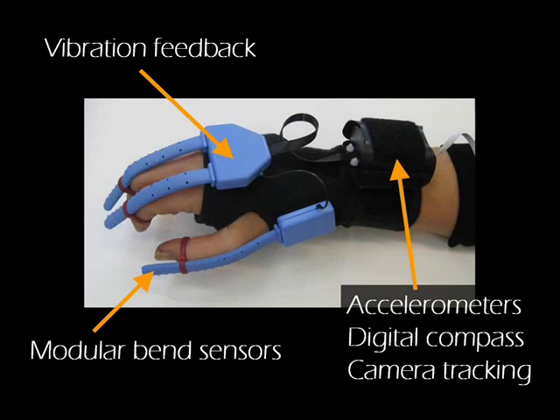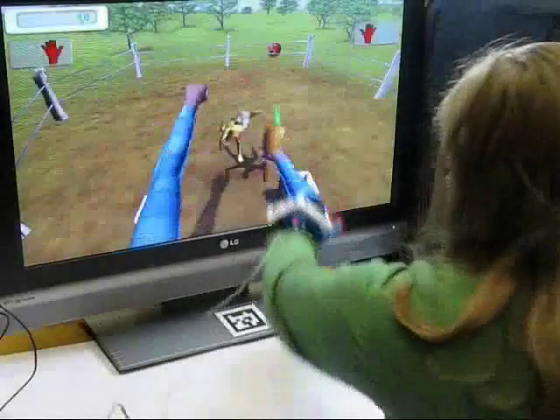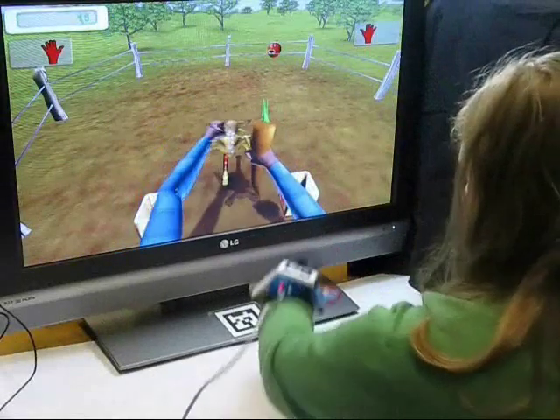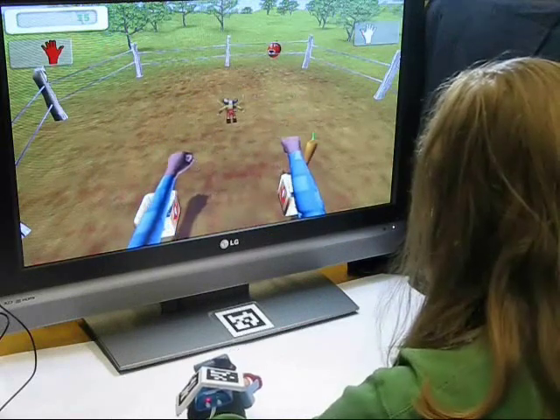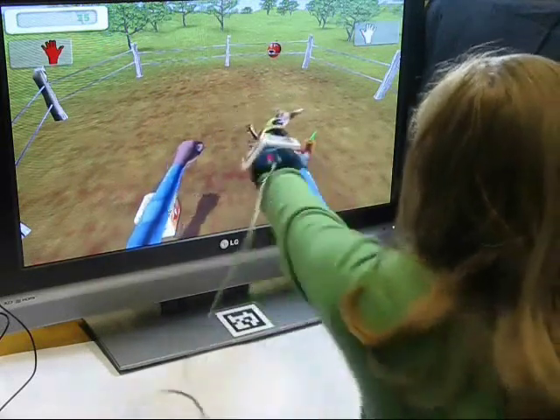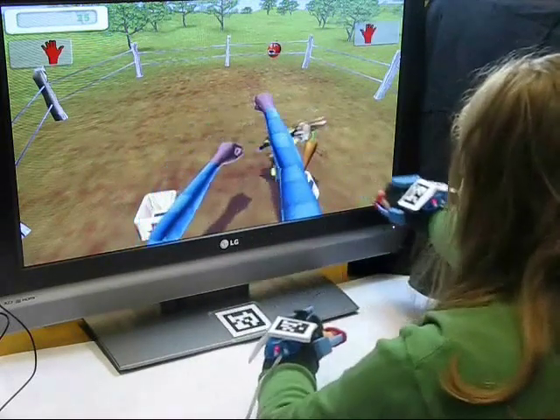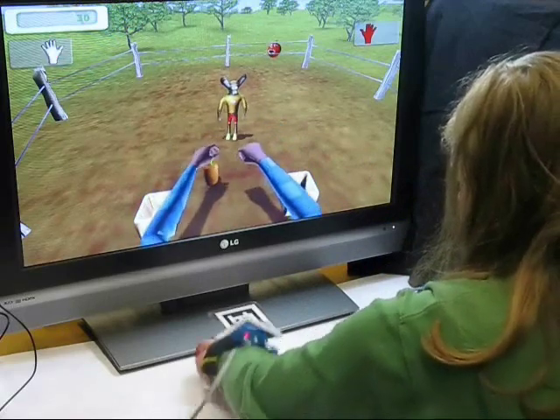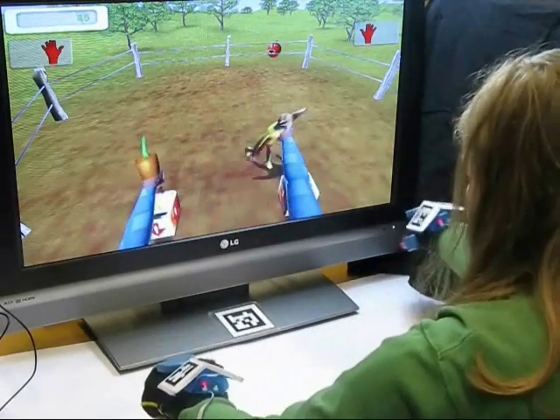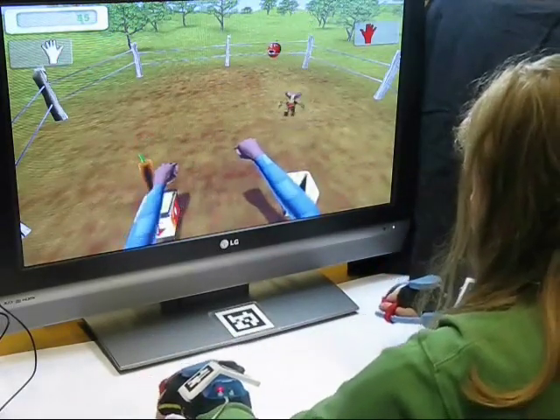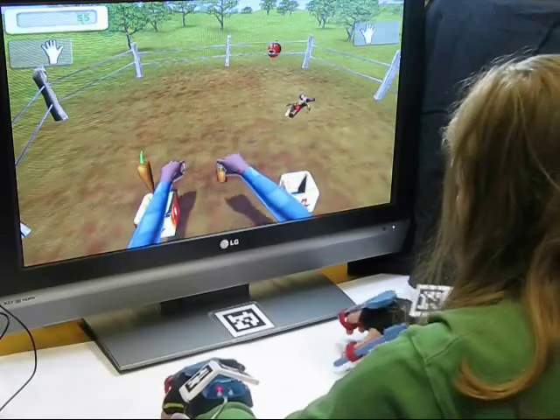The movements of the patient's arms and hands are measured using custom designed modular gloves, which can be easily fitted even to patients with very cramped or swollen hands. To maintain high patient motivation, the arm movements are embedded in entertaining tasks. In this example, the patient must reach and grasp for carrots while fending off the evil rabbit.